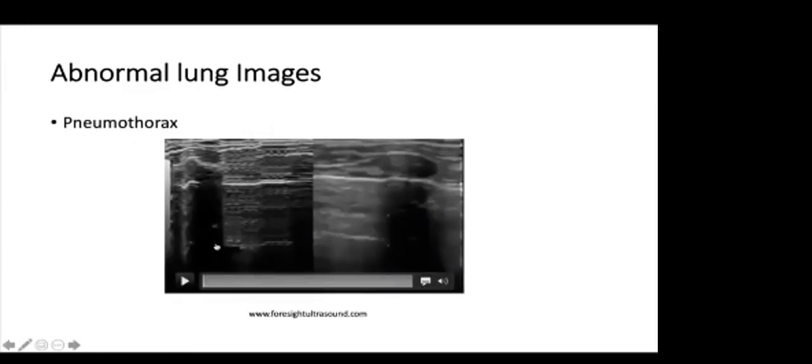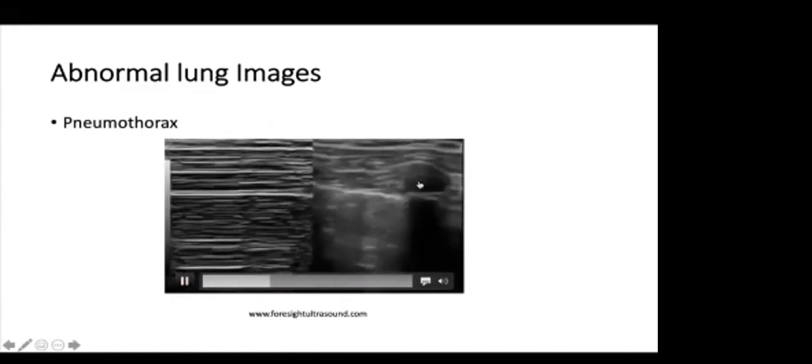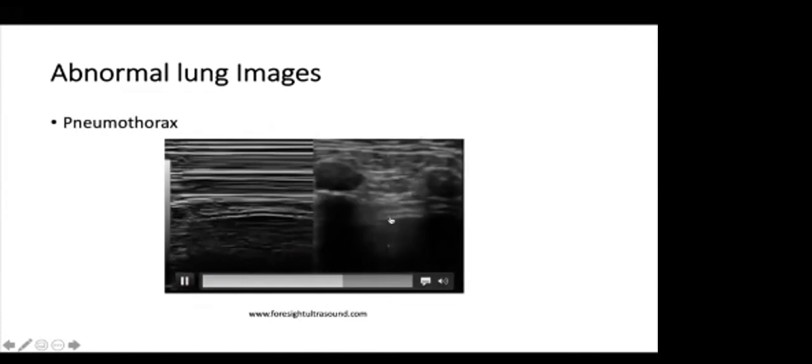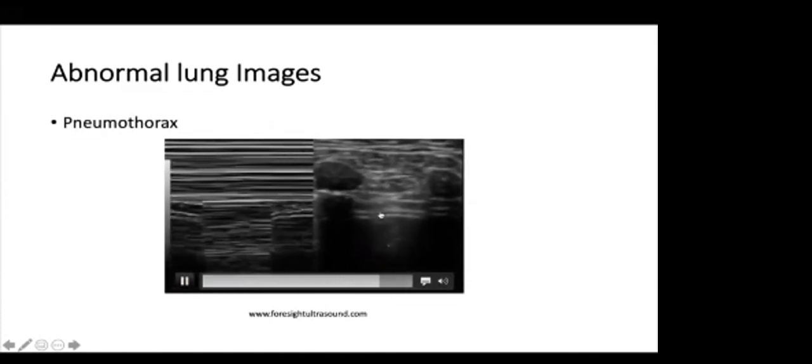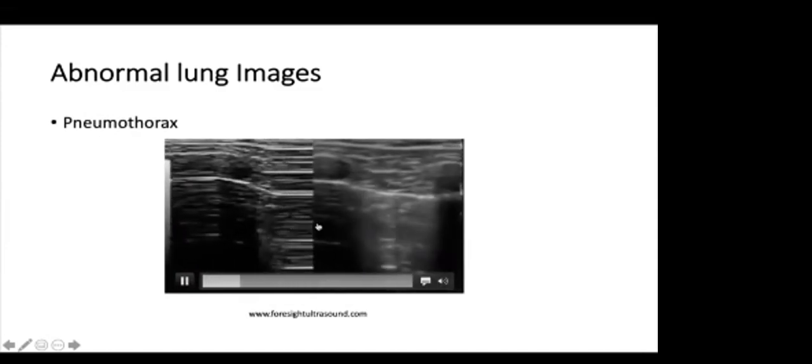On this slide, you can see a video. I would like to look first to the right side. It shows pneumothorax in B mode. First, we're going to see a rib and a shadow. As it moves to the right, there is no movement. Another rib and shadow, and then you can see pleural movement. But just when it moves to the right, the movement stops. So let's say that this transition is the lung point.